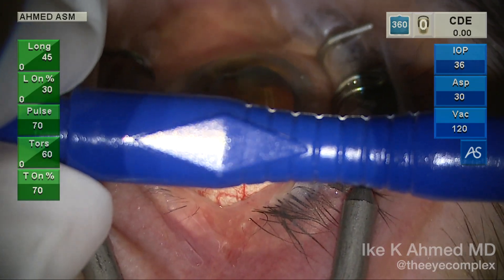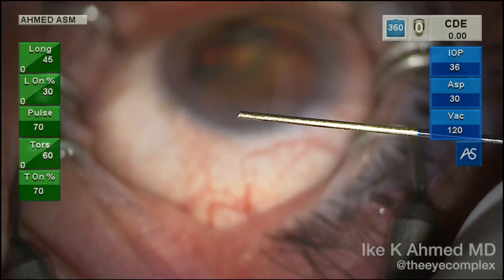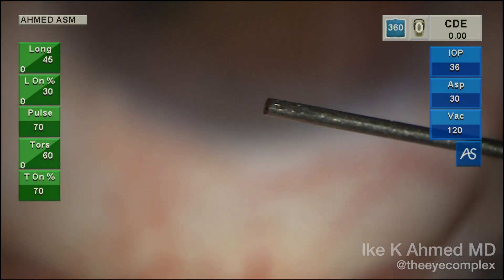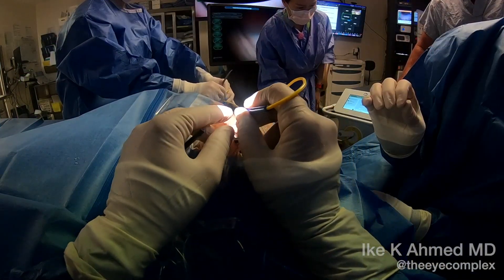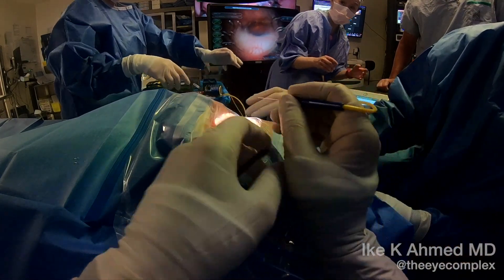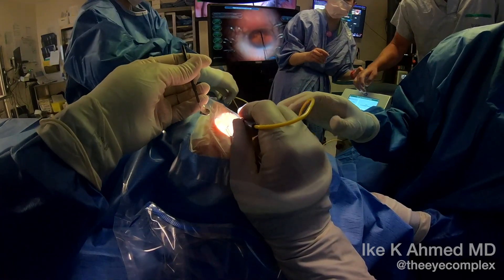This probe has a diamond-shaped elevated platform where the first finger will be placed to ensure the bevel, which is 25 degrees, will be nicely opposed to the angle. Here we're showing the grip, with the first finger on top of that platform, and placing the probe through the incision.